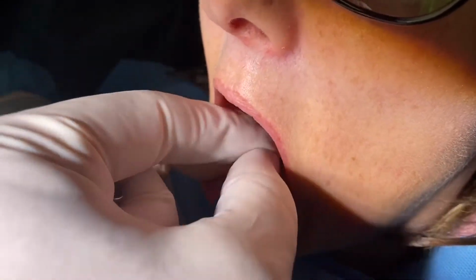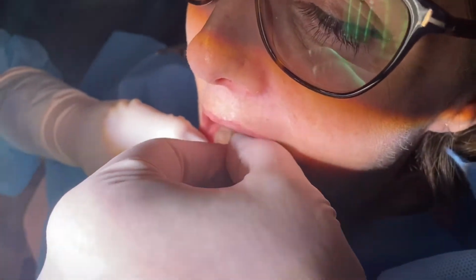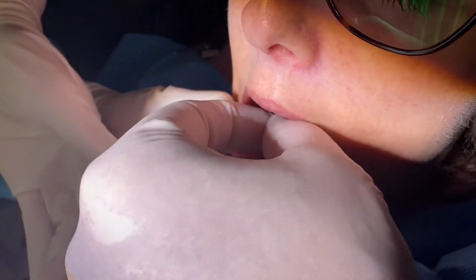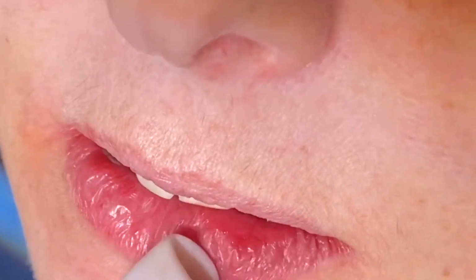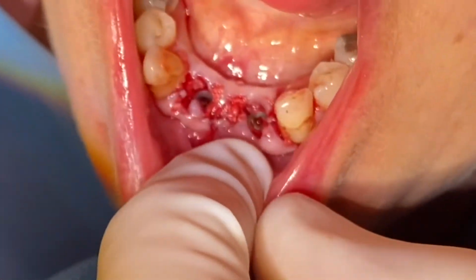The drilling, we unfortunately didn't get that videotaped due to COVID. You know, we're still getting back on our feet. Anyway, so once we take the guides off, the implants have been positioned based on that surgical plan, and then we're able to come back and start to build our temporary bridge, which is what this video is more about. And by doing so, the patient actually can have the transitional the same day that they're in for the implants.